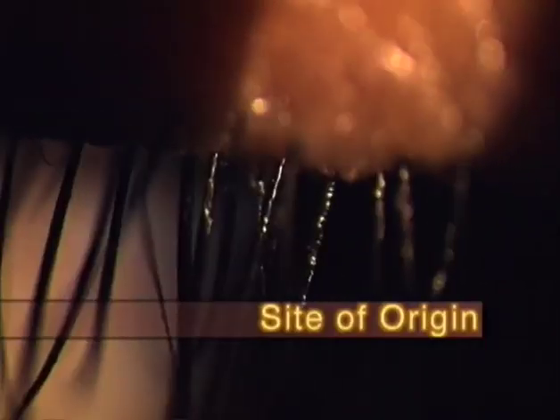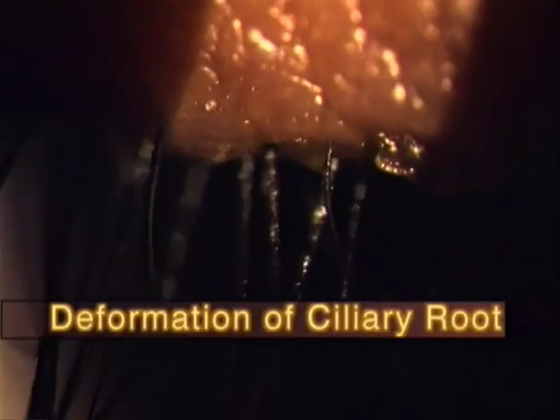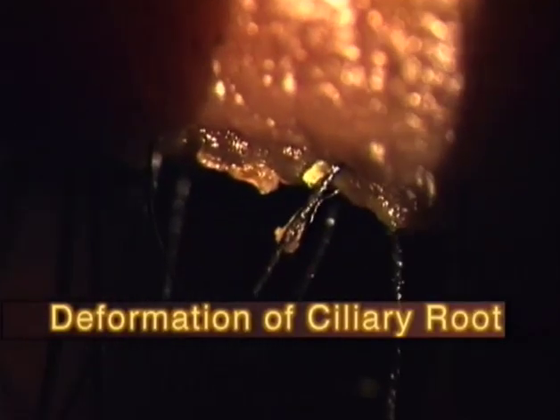In chronic conditions, the site of origin is more difficult to assess because the secretions may cover the cilia as well as the skin surrounding them. We have to look for other signs, such as, here, the associated deformations of cilia roots, to identify the origin of the disease at the ciliary glands.